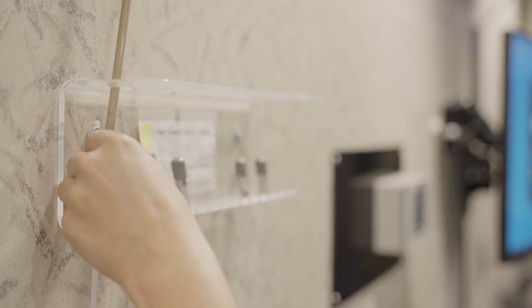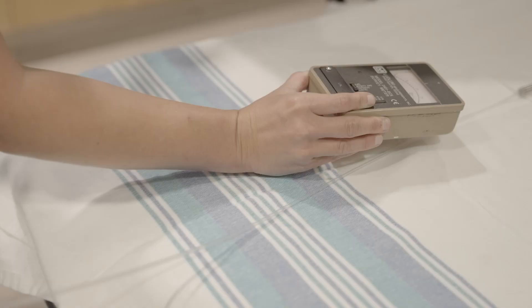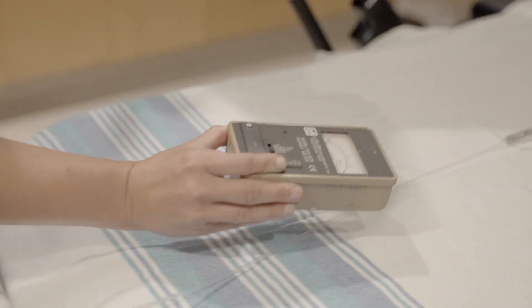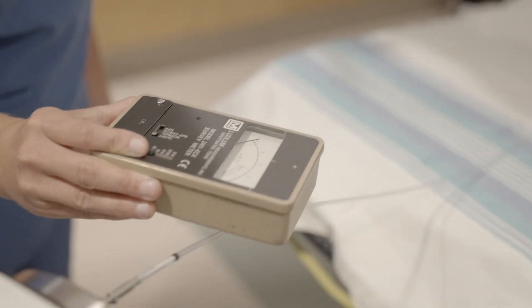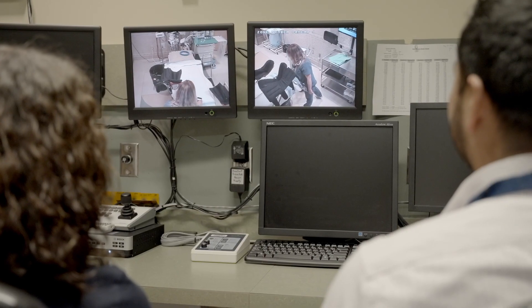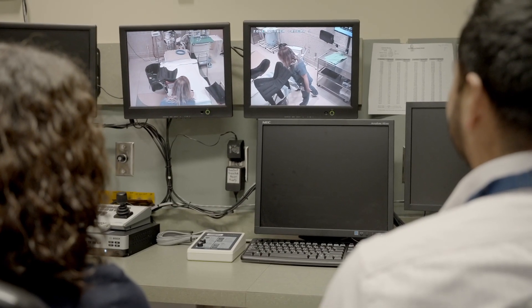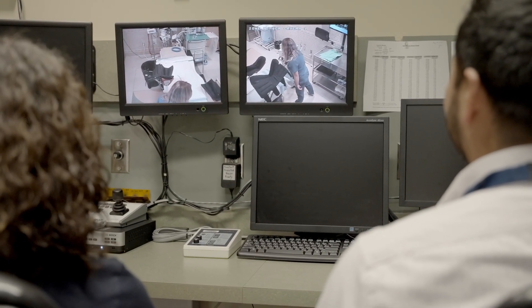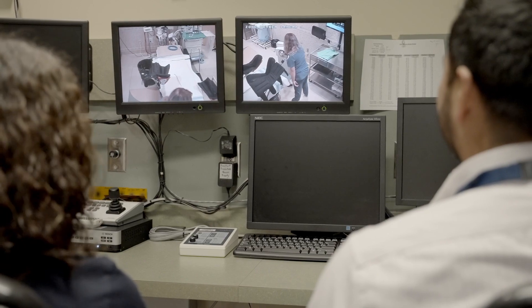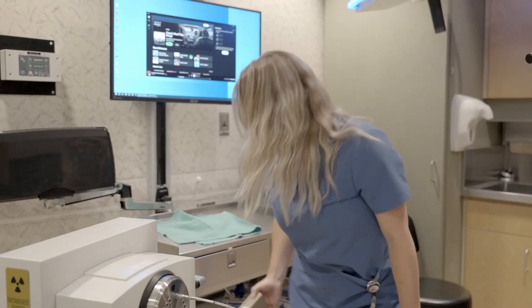During treatment, the radiation source will travel through the transfer tubes to the applicator, which is located in the tumor area. Once the treatment is complete, the radiation source will travel back into the radiation housing unit. No radiation has been left or implanted into the tumor area. Therefore, you are not radioactive.